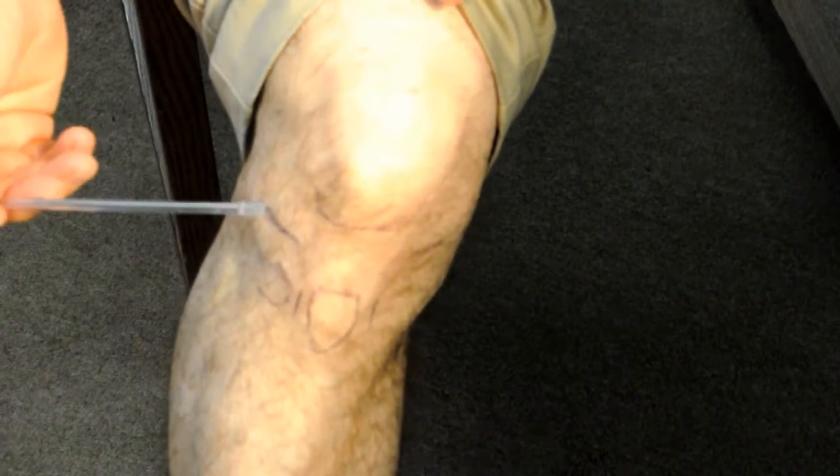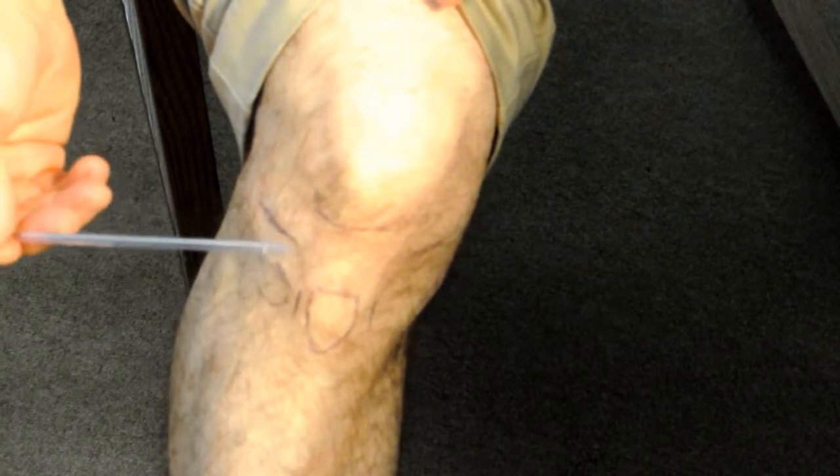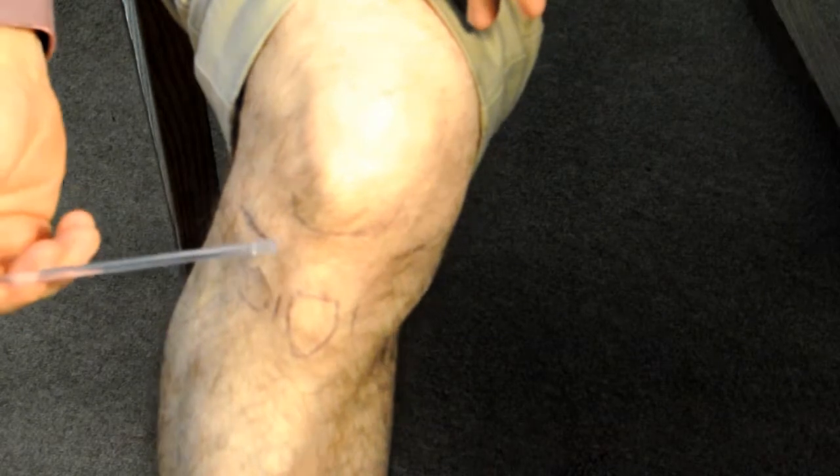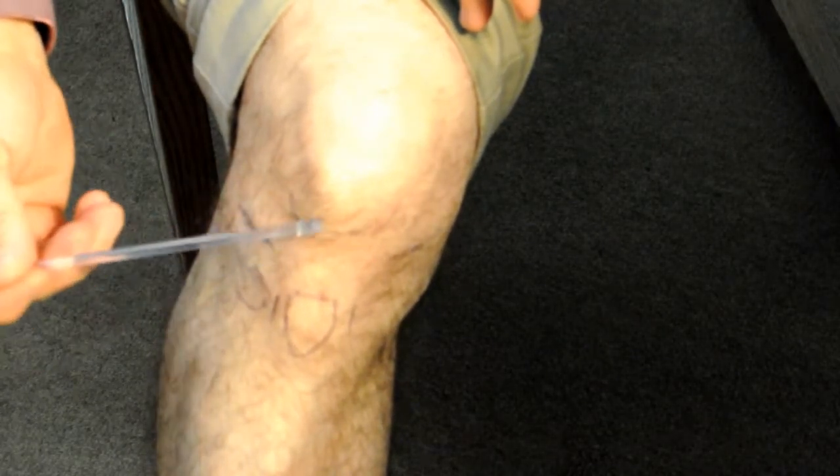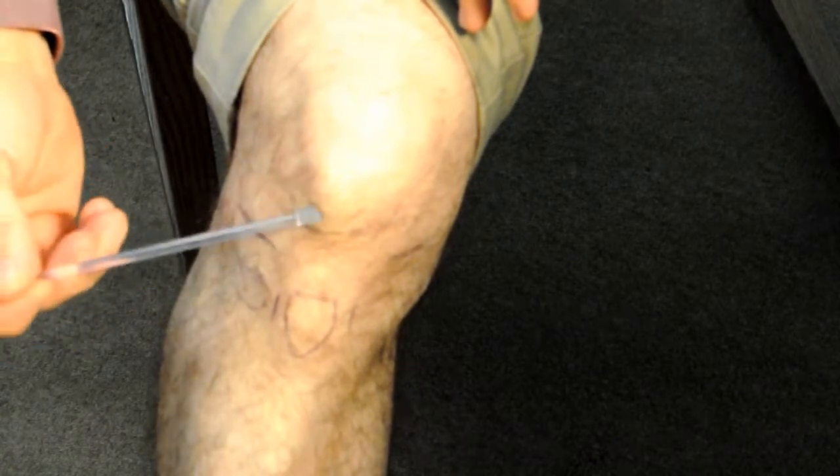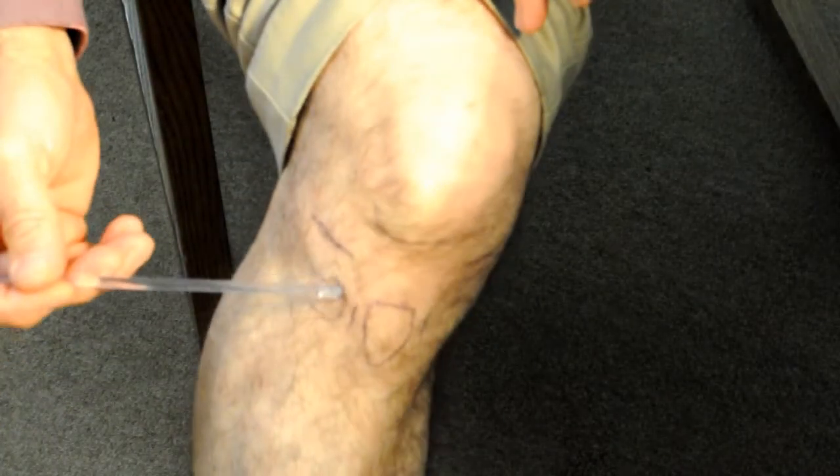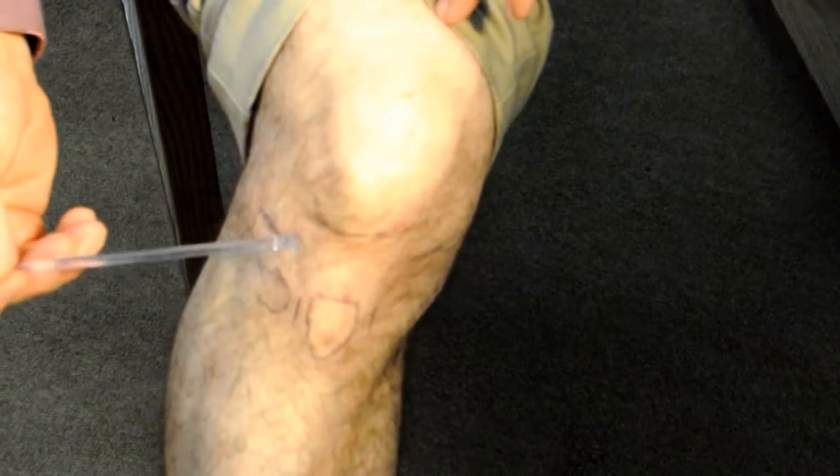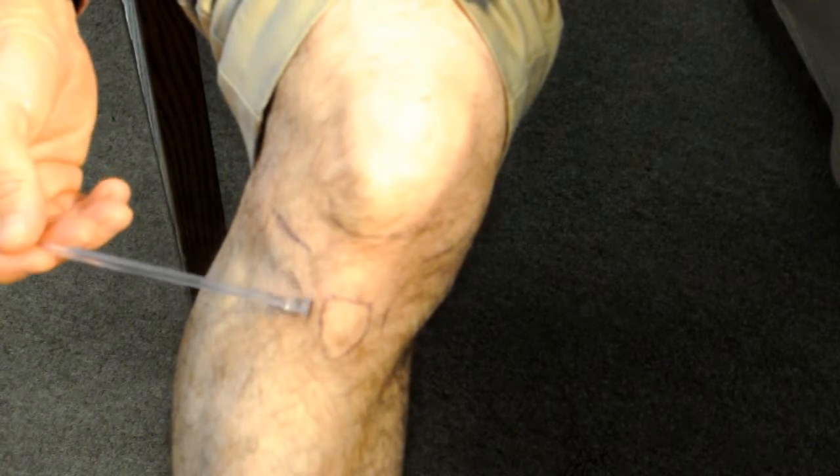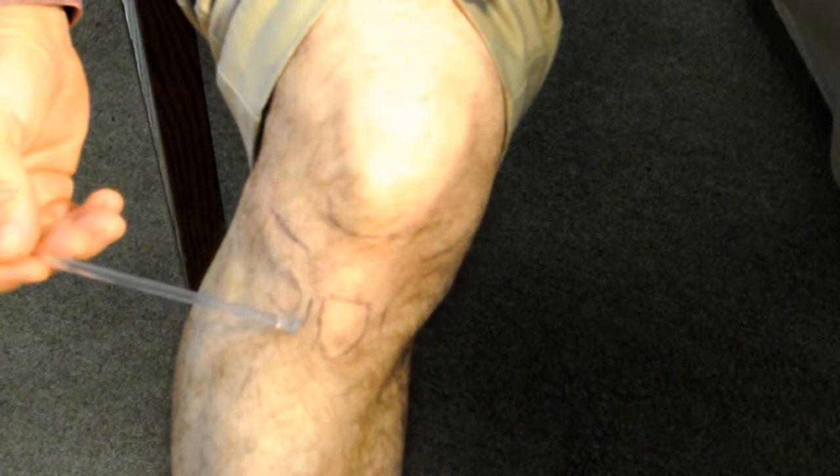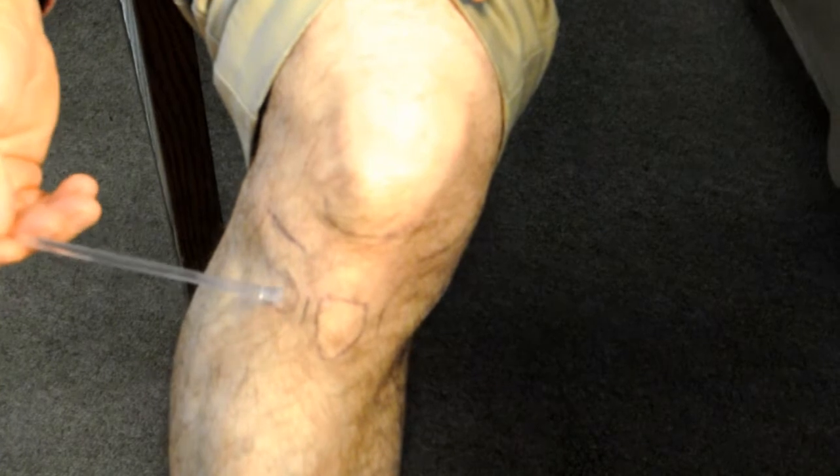For those not particularly familiar with this surface anatomy, you can see here on my right lower extremity that I have marked with pen the inferior aspect of the patella, the tibial tubercle, Gerdy's tubercle, and the lateral joint and medial joint lines.